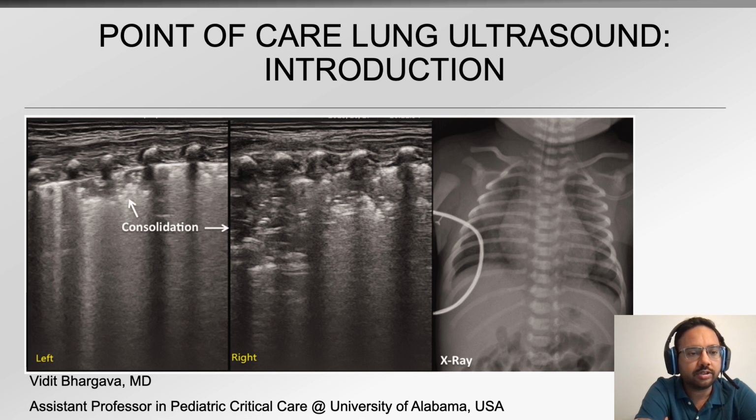This is only an introductory talk to point of care lung ultrasound, and there are lots of things that could be added to this talk. So let's begin here, and then in subsequent talks, we will build upon this.